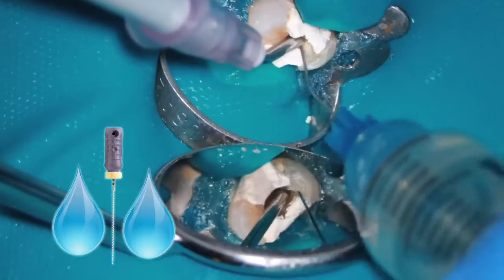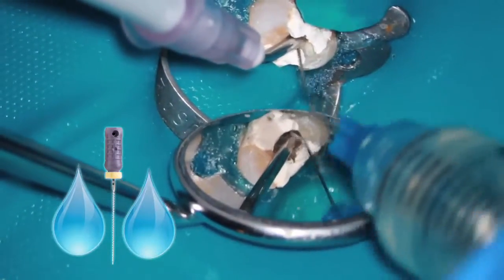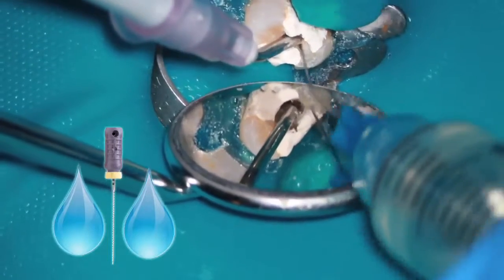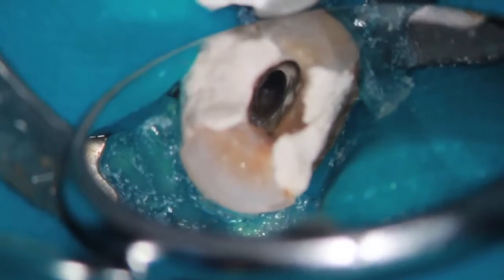So that will complete our final instrumentation and our initial cleaning protocol. And now we're going to irrigate well. We're going to activate it, confirm patency, and begin fitting our obturation. Look at the buccal lingual direction of this canal, and look at the fin off of this section right here, off the buccal aspect. And by instrumenting as 2 different canals, you can see how these instruments conform to the natural morphology. This way addressing the whole thing, the natural anatomy all the way.